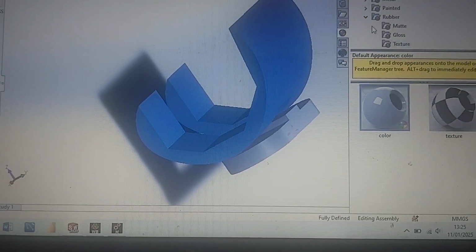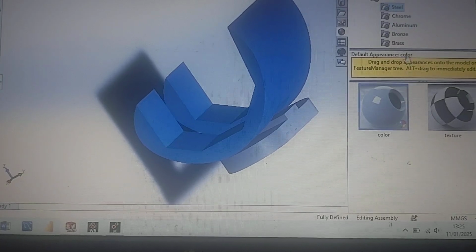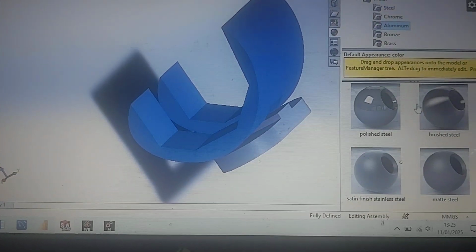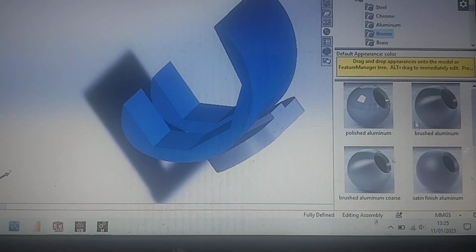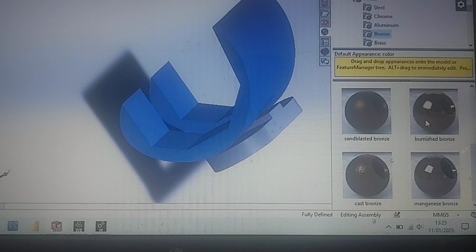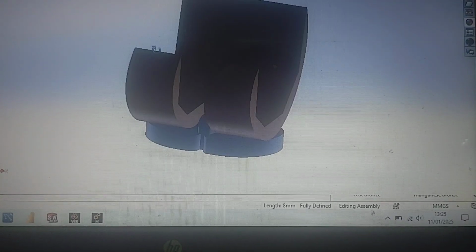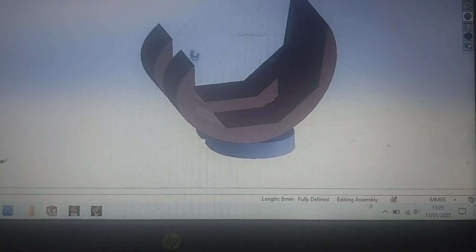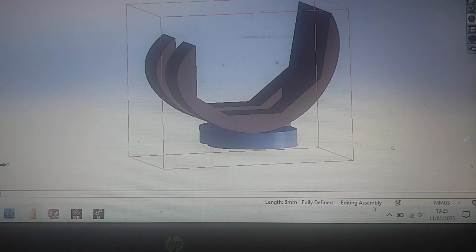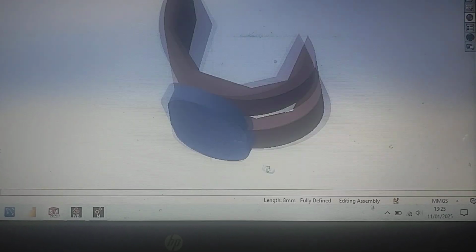You can change color on your own wish, steel, aluminium, or any other material if you want to change. This will give beauty to it. So this is more beautiful, more attractive. Then the assembly of these two designs: there are basically two designs, the upper one and lower one. These are separate designs. The lower one is also made by SolidWorks.